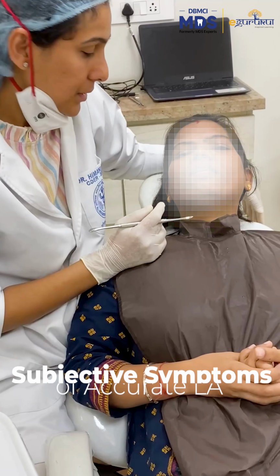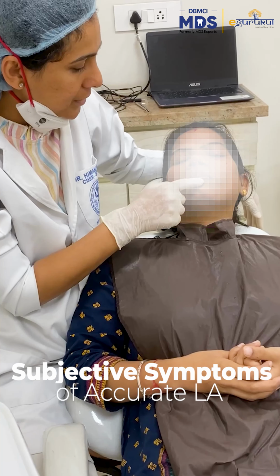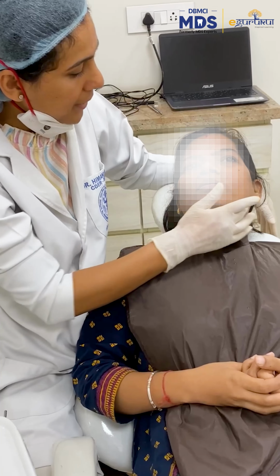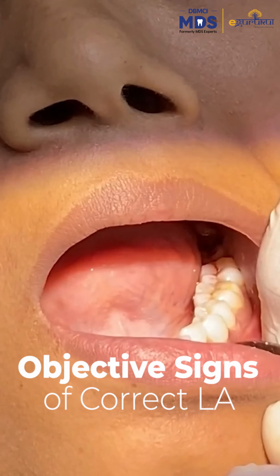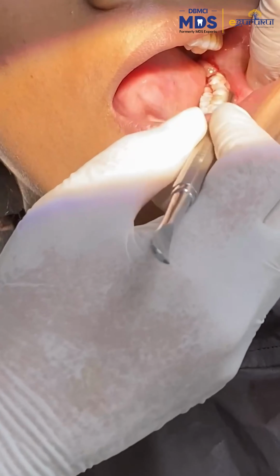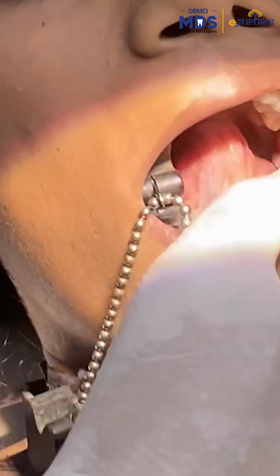Alright, now the next step is you will check whether the patient is symptomatic or not. I am asking the patient if there is any numbness on the chin, numbness on the lip, numbness on the half side of the tongue. And here I am checking the objective signs. Instead of asking the patient, I am putting my instrument in the premolar region and I am checking whether there is any pain or not. Her eyes will tell me whether there is pain or not.